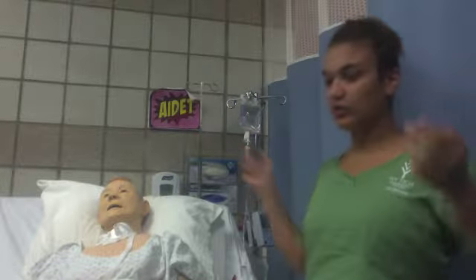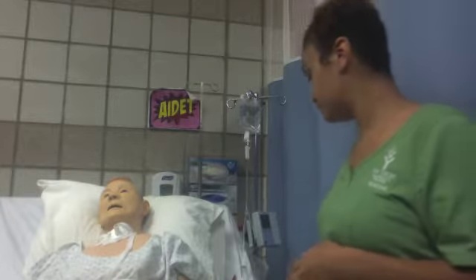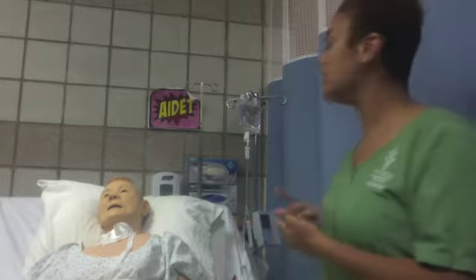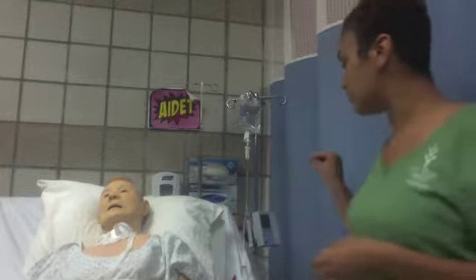All right. So I'm going to go ahead and call in my second nurse. I'm going to make sure that she's in here while I've explained the procedure. She's explained the procedure. She's verified consent, that the orders are correct, the medications are correct. She's verified any allergies that have been had. She's checked the site. She's checked the IV. She's done all that as well.